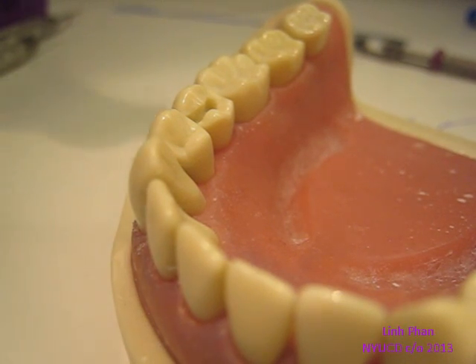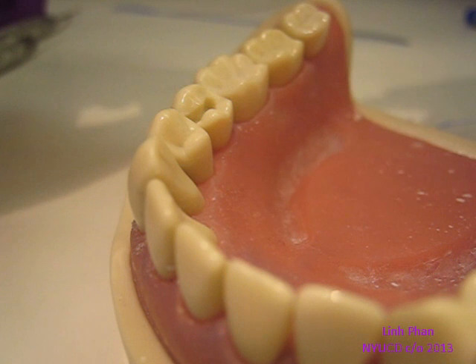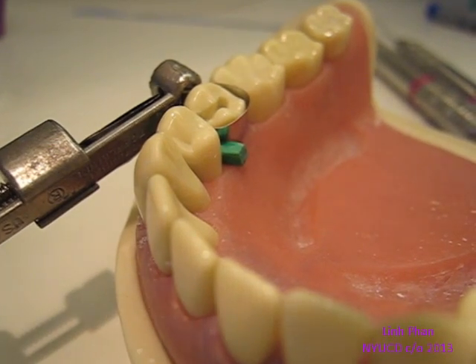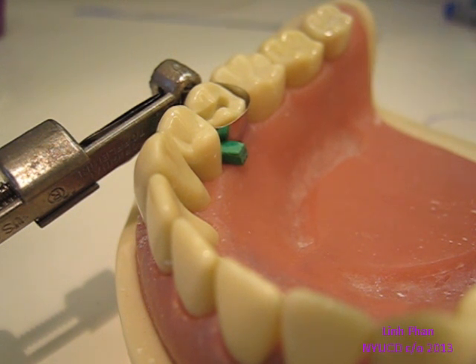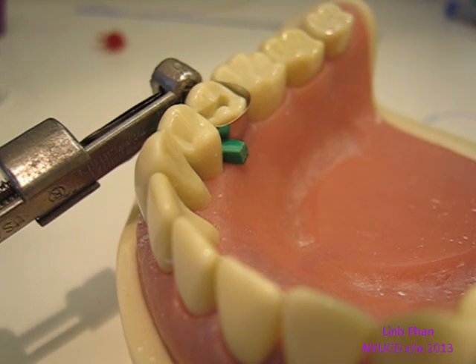So the first thing you want to do is put your matrix band on and wedge it so that way you don't get any overhang. So you have your wedge and your band on, and it's not as important to have it one millimeter above because it's not an amalgam. So you want to start by making sure there's nothing in there, and then you put your bond on.